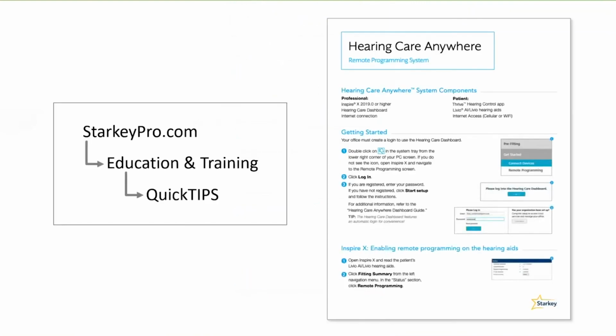As with all of our other features, if you want more detailed step-by-step information on how to answer a request from Hearing Care Anywhere, you can download our quick tip by going to starkeypro.com or the Inspire online homepage and search for our quick tips.